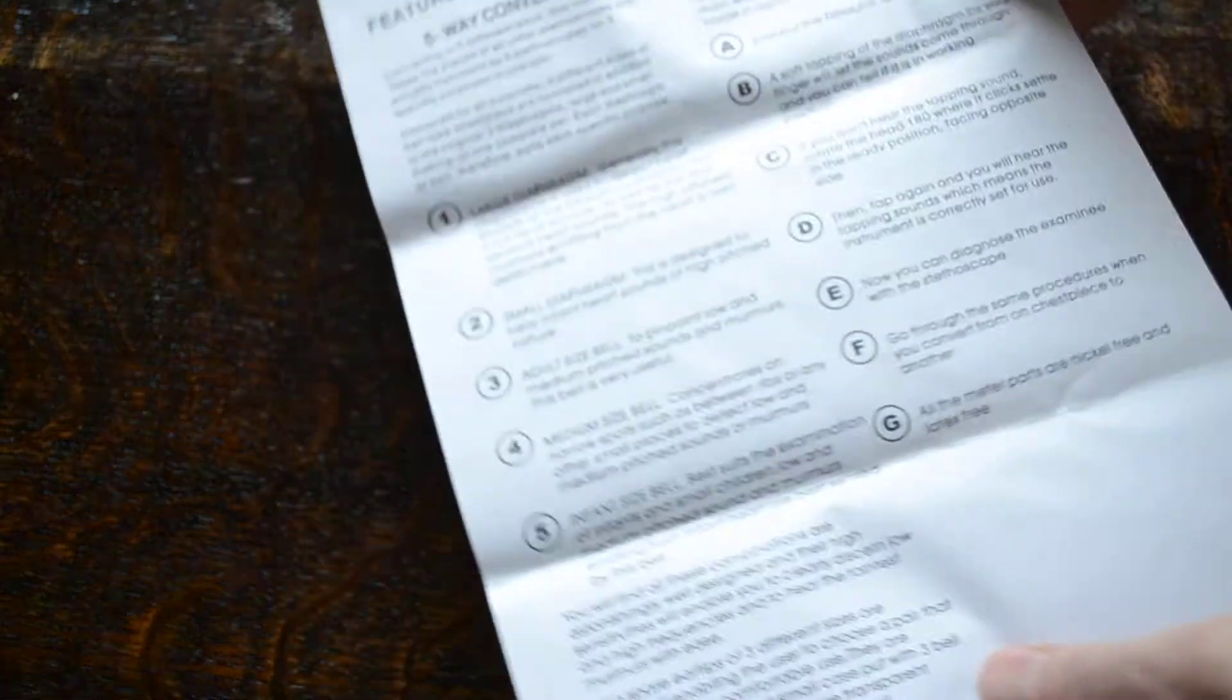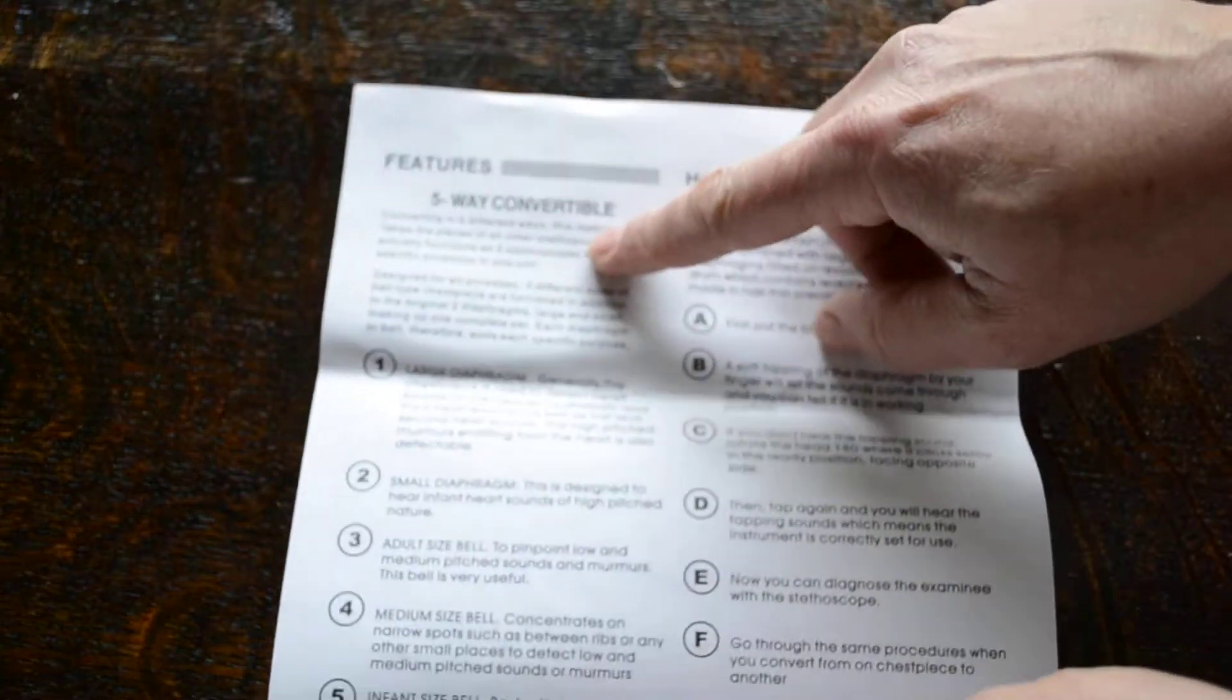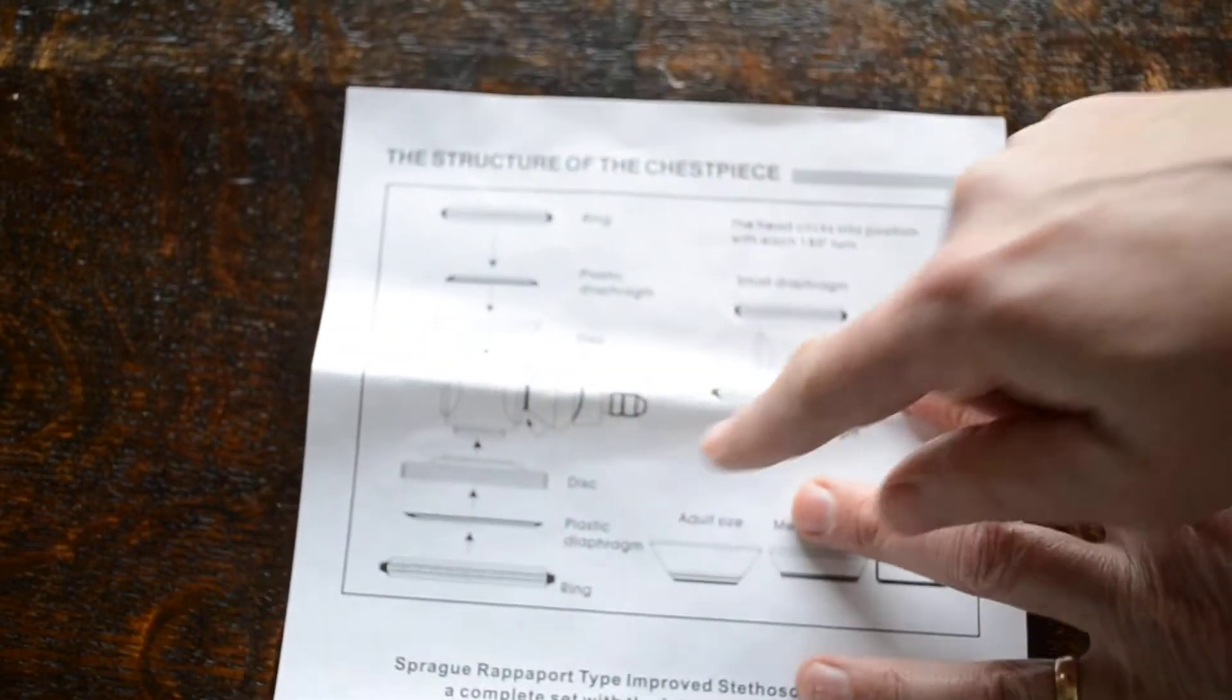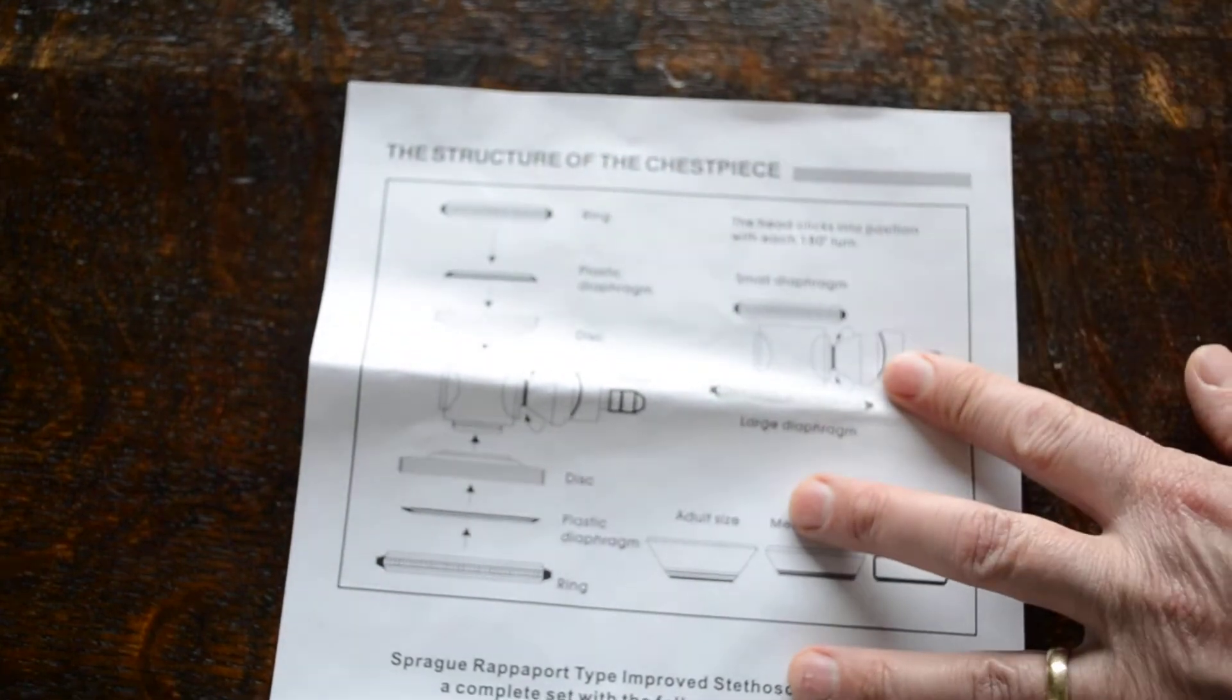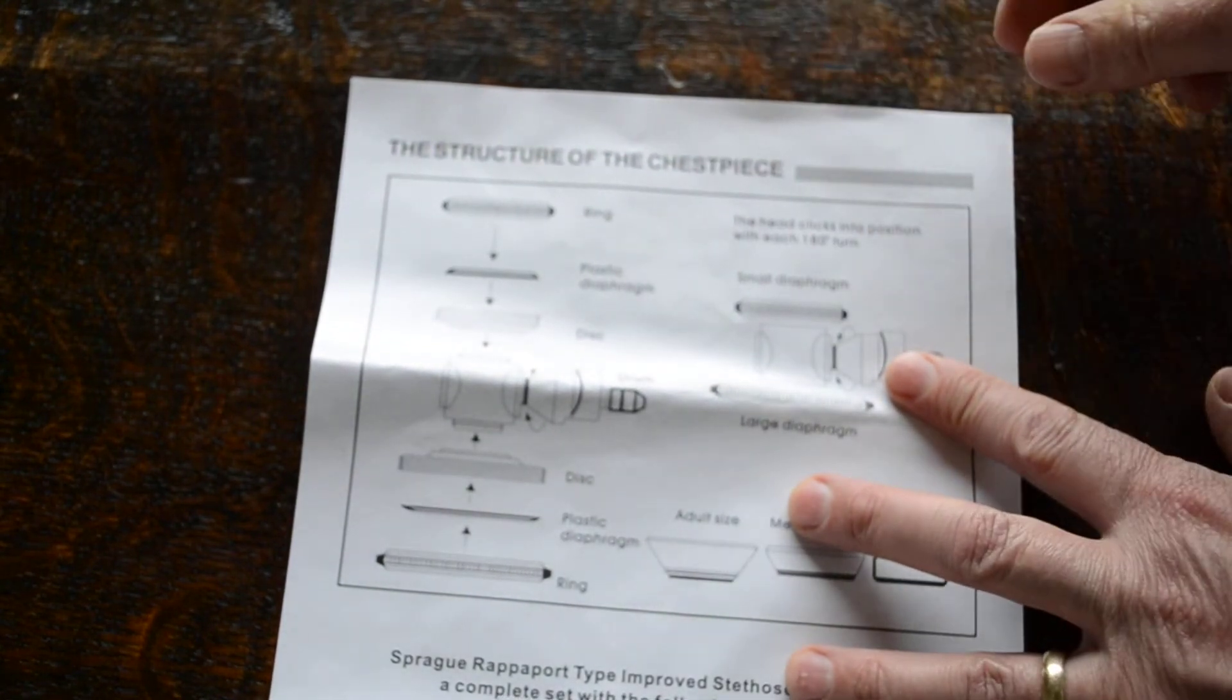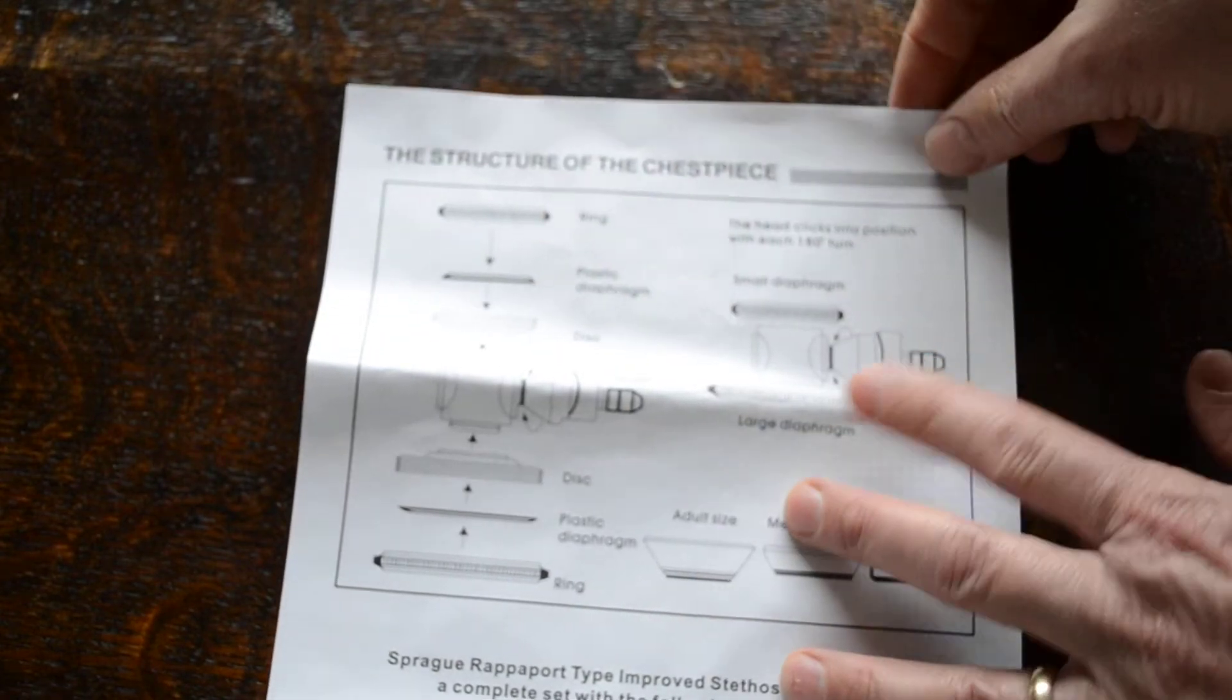Standard pack insert in terms of how to use and the features. It's five-way convertible. The back gives you basic fitting instructions. It's useful to keep these so you know how to rebuild the unit if you're putting diaphragms in, where they go in relation to the discs and the rings.